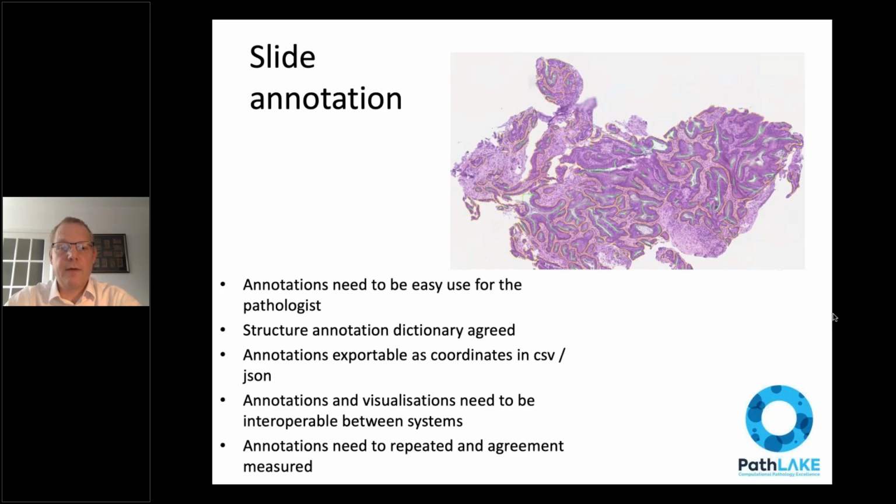It's important that everyone, of course, uses the same annotation tool to make those judgments. So the creation of this dictionary takes some time, and it's important that you do take time to do this properly in order to ensure that everything you need annotating can be annotated accurately and as efficiently as possible.